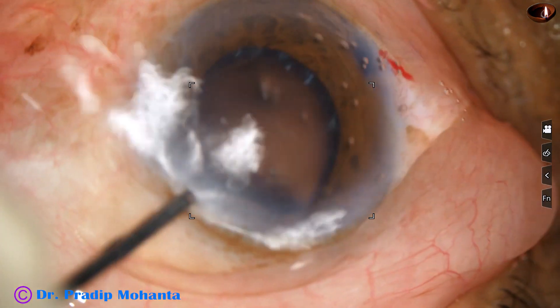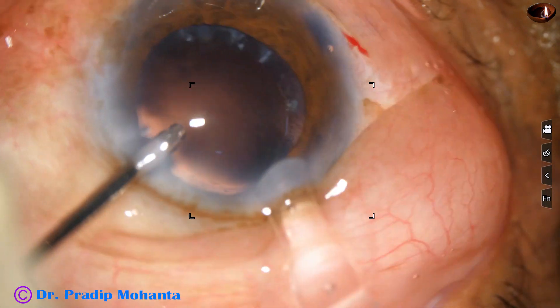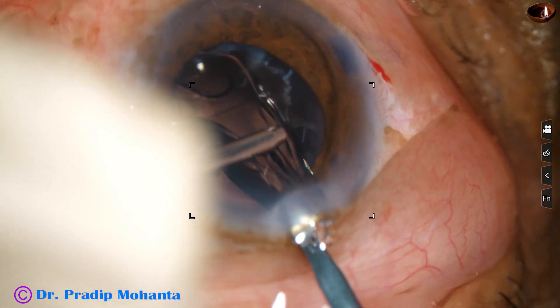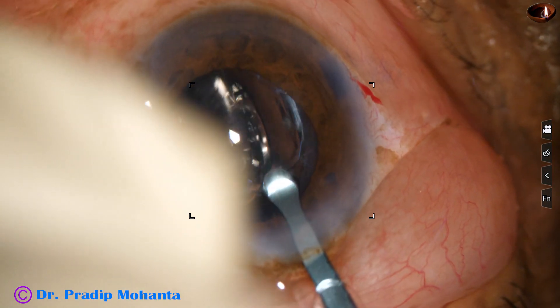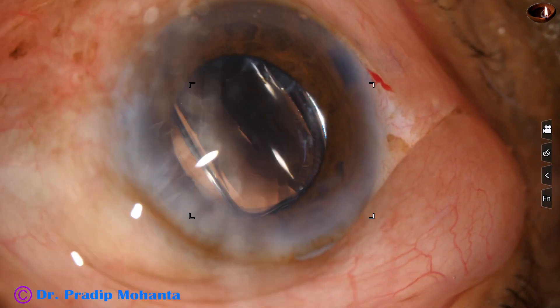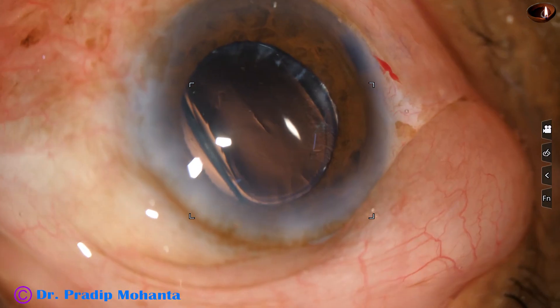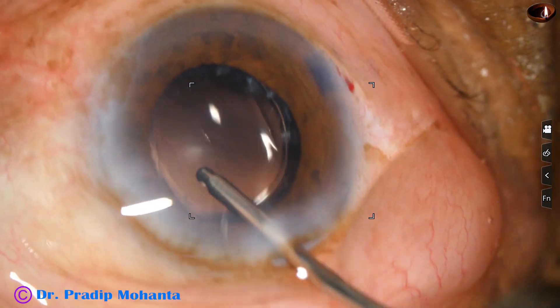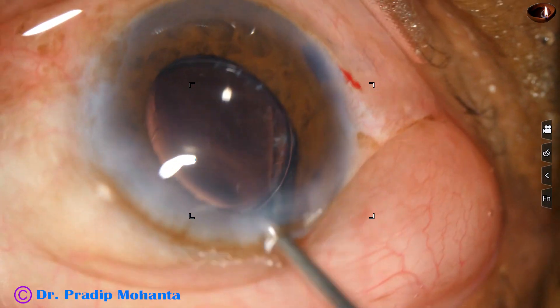And this is hydro-implantation of a single piece monofocal intraocular lens. The lens has gone into the capsular bag. Now see what happens as I rotate the lens.